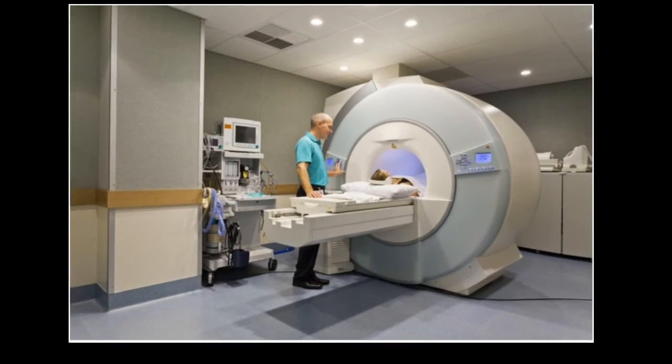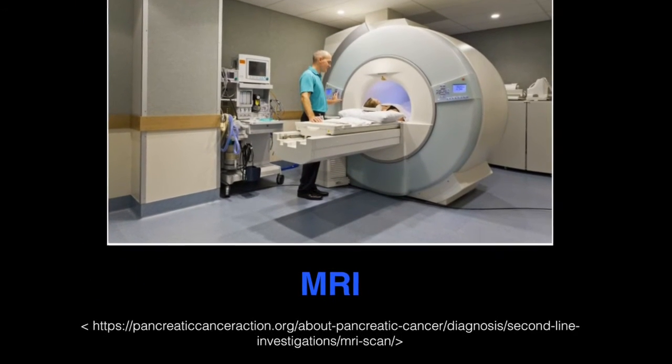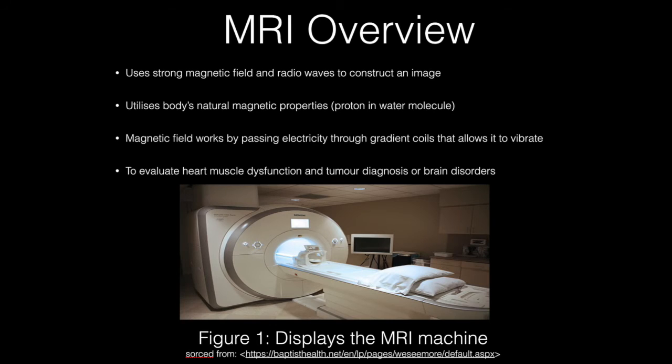The next imaging modality that we will be examining is magnetic resonance imaging, which is also known as MRI. MRI is an advanced imaging modality that uses a magnetic field and radio waves to construct images inside the body. MRI utilizes the body's natural magnetic properties, the protons in the water molecules, to produce a detailed image from the desired body part. Normally, the water molecules inside our body are randomly arranged, but upon entering the MRI scanner, the two magnets of the scanner cause the protons to be aligned in one direction, either south or north.